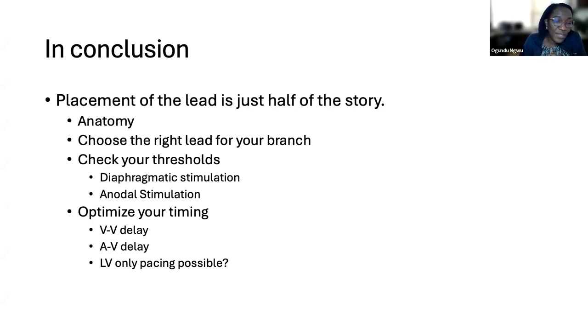For every 1% increase in your BiV pacing, you have a 6% reduction in heart failure and death. And for every 1% increase in effective BiV pacing, you also have a 10% reduction in death and adverse events. So it's really important, beyond the implant, to continue to look at this patient and make sure that you are maximizing the benefit from the CRT device, whether it's a pacemaker or a defibrillator.